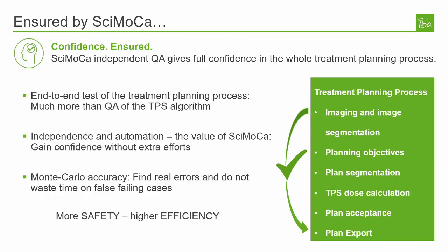SciMoCa works automatically in the background, without any need for regular human interaction. All you need to do is export the patient plan from your treatment planning system, and as soon as the data is received, SciMoCa will automatically start the calculation.